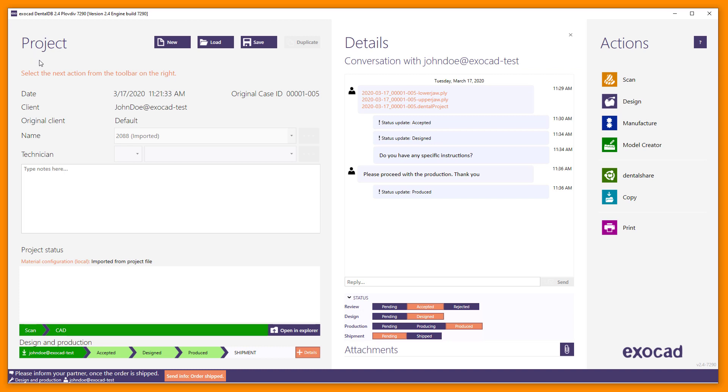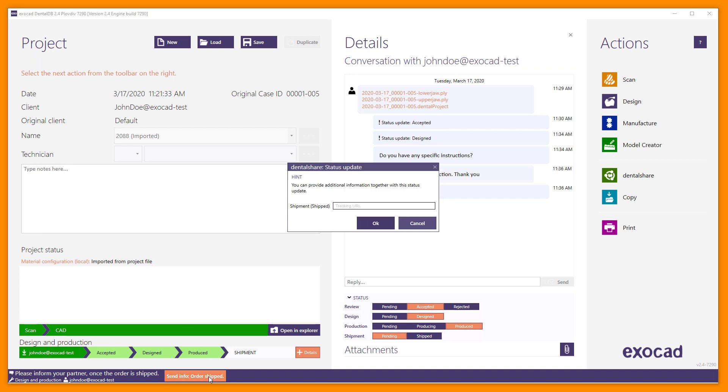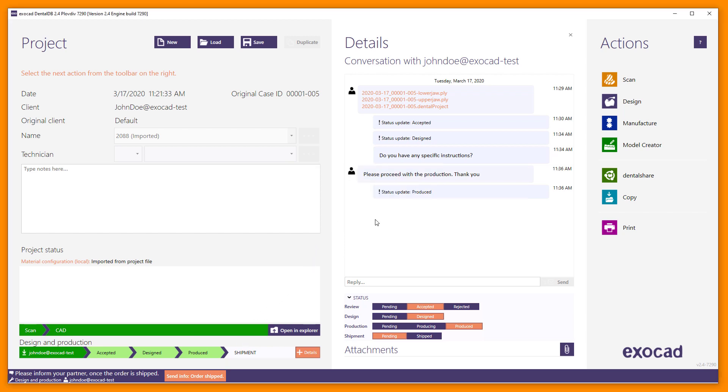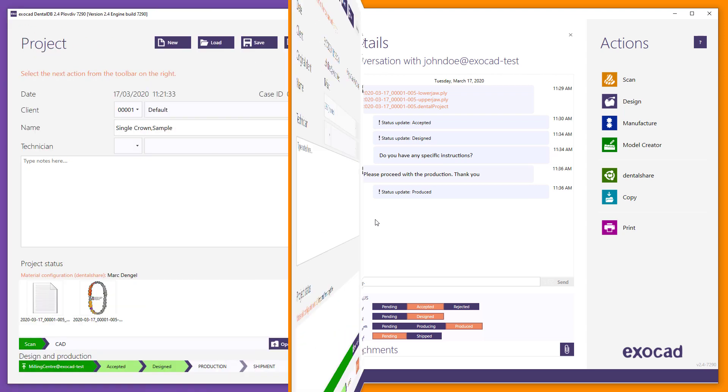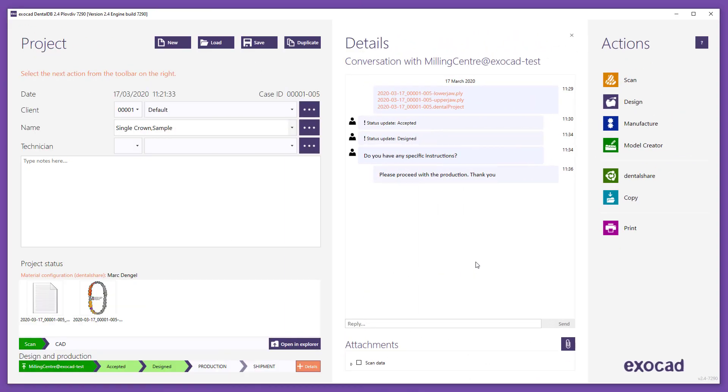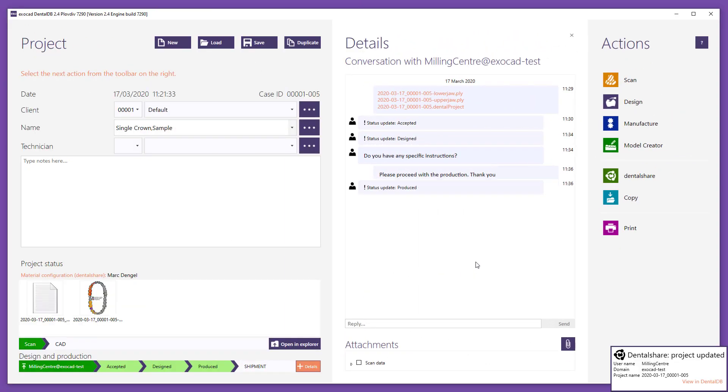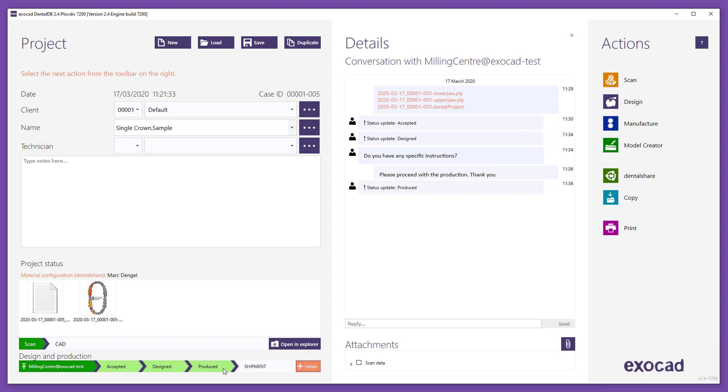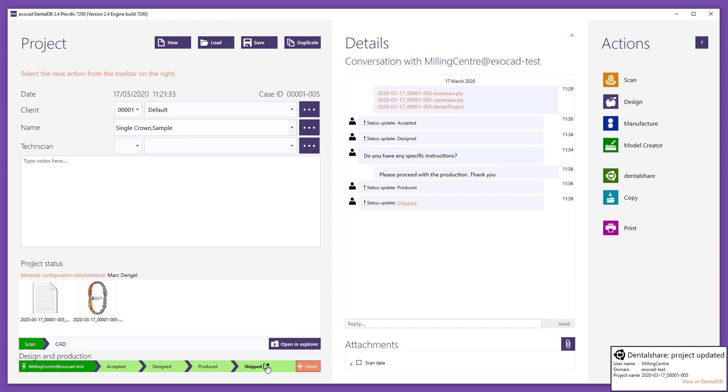If setting the status to Shipped, you can optionally insert the URL to the tracking number. Sender will be informed and by clicking on the bold Shipped text, he can open the tracking URL.